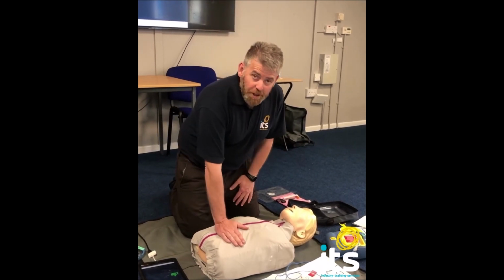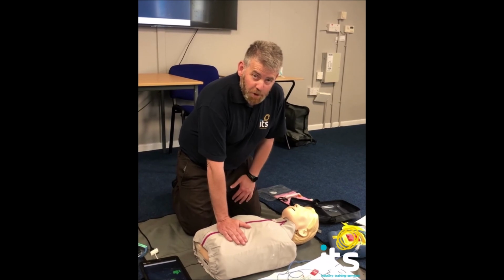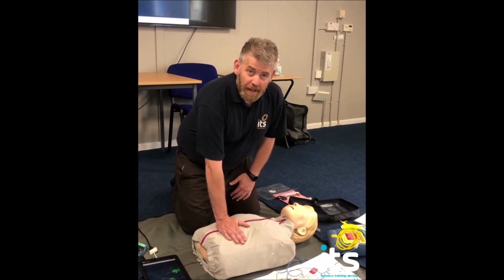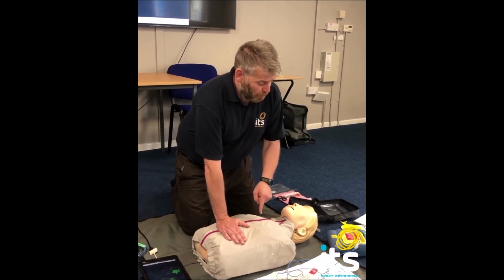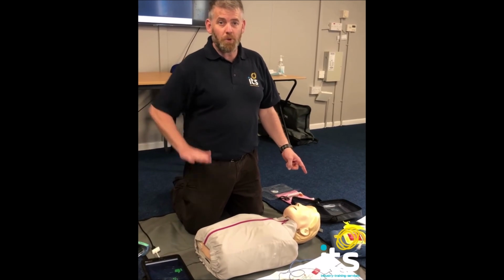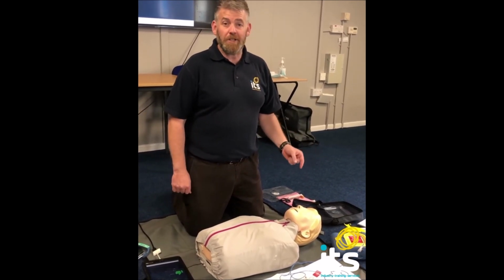Do a 10-second breathing check on the patient. If at the end of that 10 seconds the patient's breathing, we're going to put them into the recovery position. If they're not breathing, we're back to CPR again. So depending on what you find will depend on what your next course of action is, folks. That's the combination of CPR and defibrillation together.